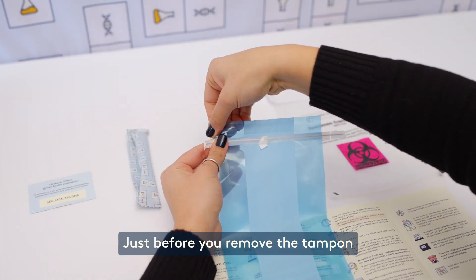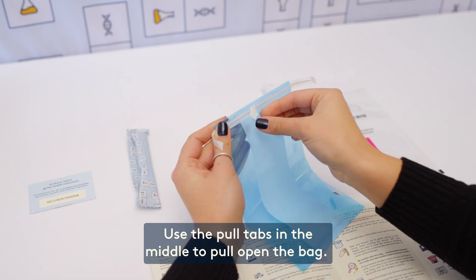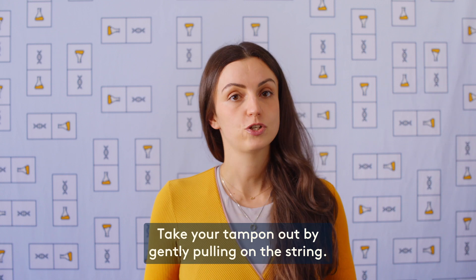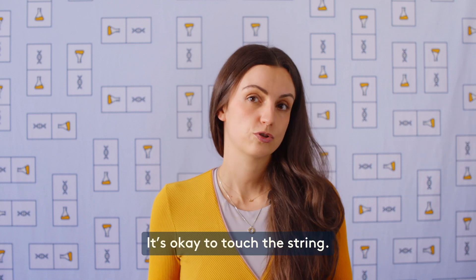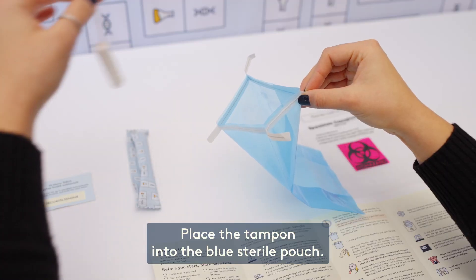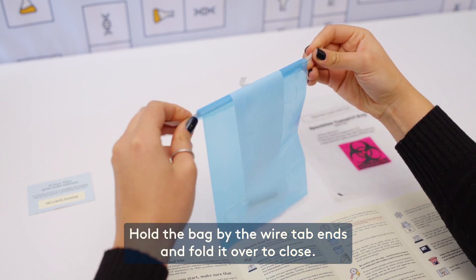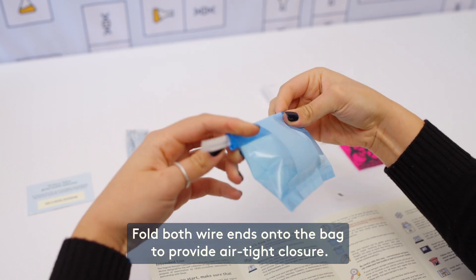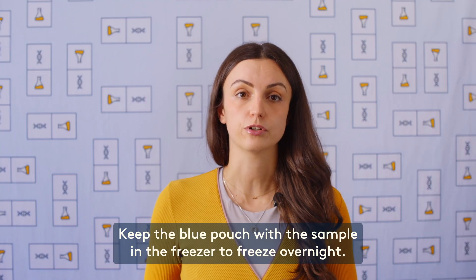Just before you remove the tampon, tear off the top part of the blue sterile pouch along the perforated line. Use the pull tabs in the middle to pull open the bag. Take your tampon out by gently pulling on the string — avoid touching the tampon itself with your fingers; it's okay to touch the string. Avoid bumping the tampon into anything like the toilet bowl. Place the tampon into the blue sterile pouch. Hold the bag by the wire tab ends and fold it over to close, then fold both wire ends onto the bag to provide an airtight closure.